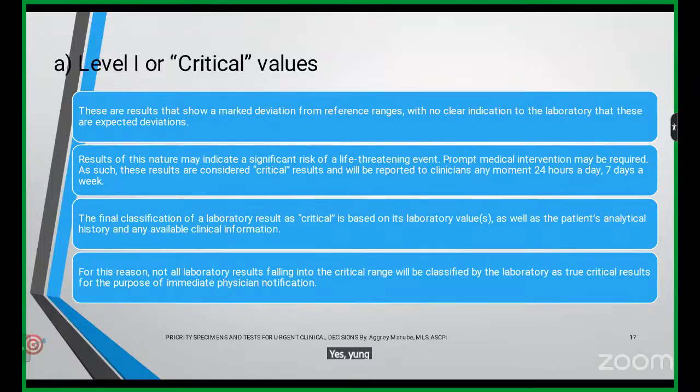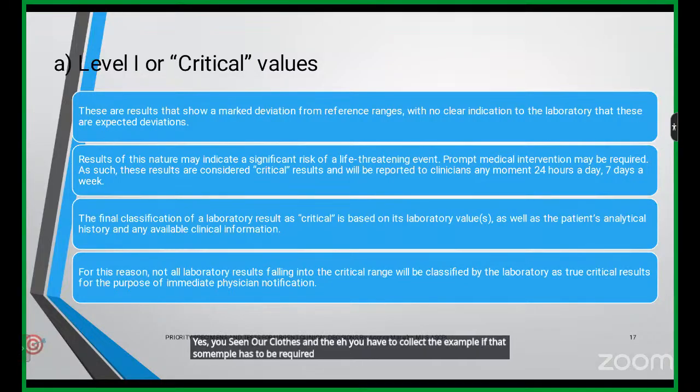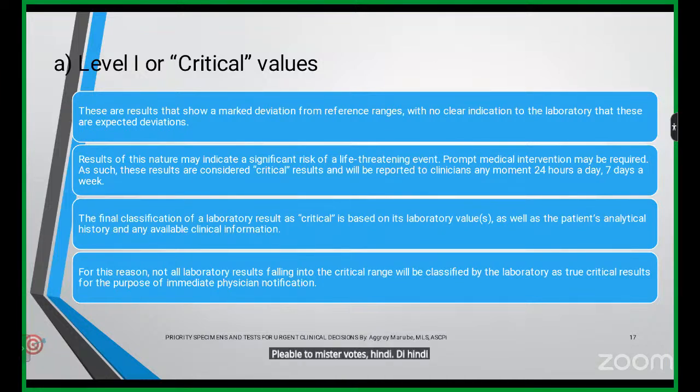Yes, you've seen a clot and you have to recollect the sample. That sample has to be recollected, and the phlebotomist should be notified about the error. This is an out of control event, and it should be called out. If the sample is not collected properly, it should be followed by a corrective action.